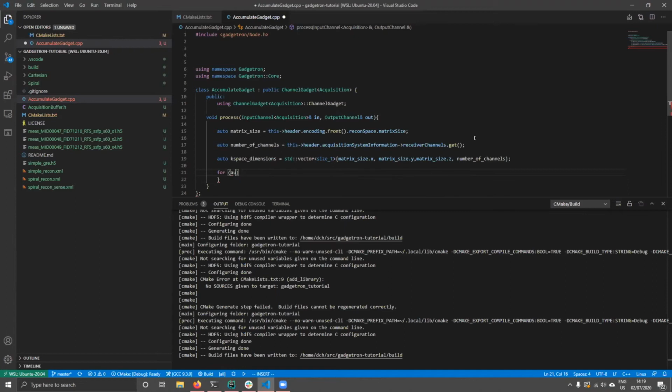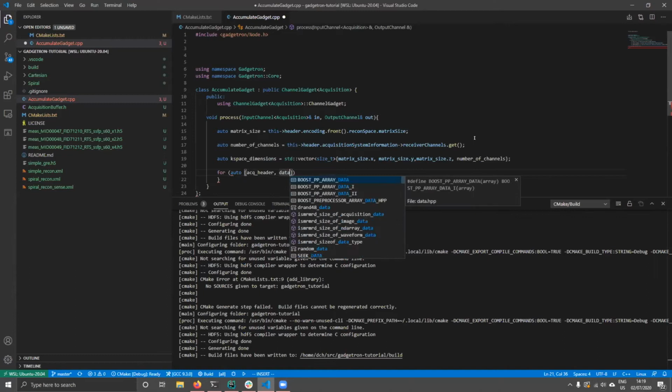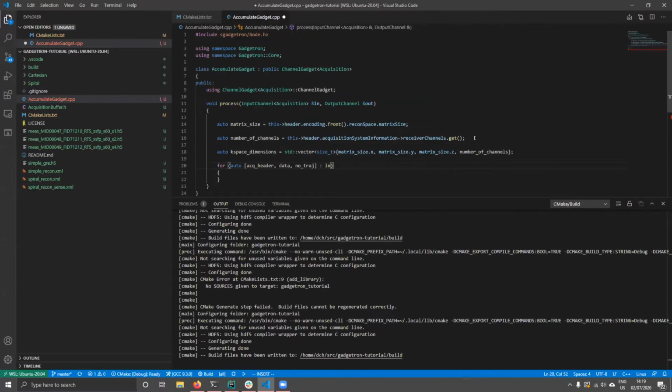So I know that an acquisition consists of an acquisition header, some data and a trajectory, but we're writing a Cartesian gadget, so there is no trajectory. This will just be none. And then we can loop through the acquisitions like this. Okay. Now, oh, we forgot something.